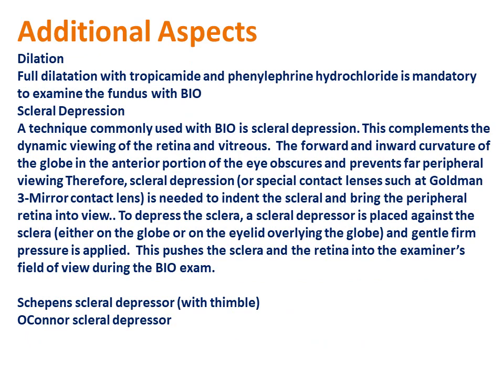An additional aspect that I have to mention while examining the posterior segment of the eye is that full dilatation with tropicamide and phenylephrine hydrochloride is mandatory to examine the fundus with the binocular indirect ophthalmoscope. Otherwise, the details that are going to be discerned will be extremely minimal and useless.